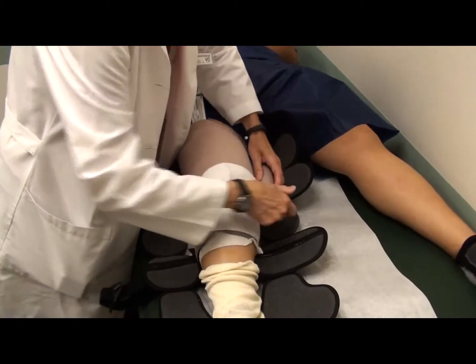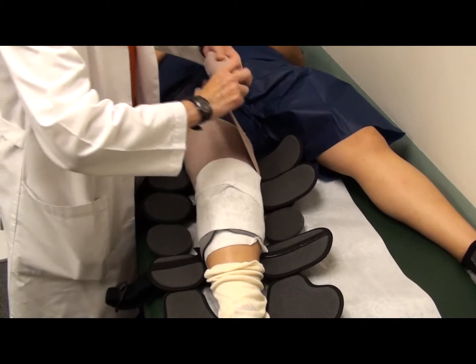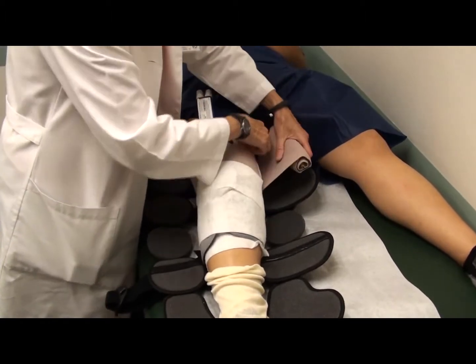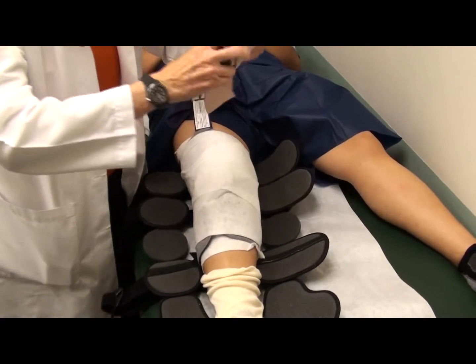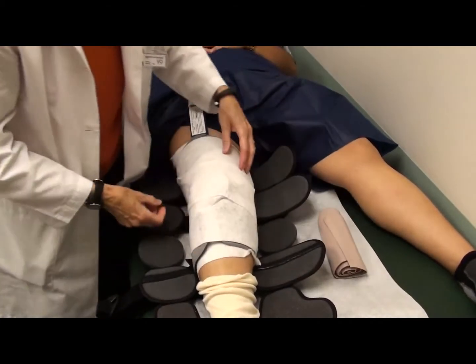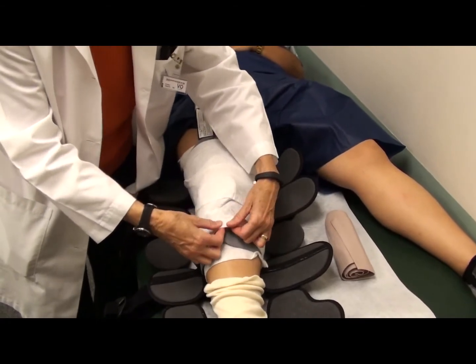Now sometimes there's a little bit of blood on the dressings, so don't be alarmed unless it's actively bleeding. Of course, that's extremely rare, but if you see any bleeding, then you would want to call us. But if it's some dried blood or looks like it was fresh, usually it's from right after surgery when we put the dressing on.